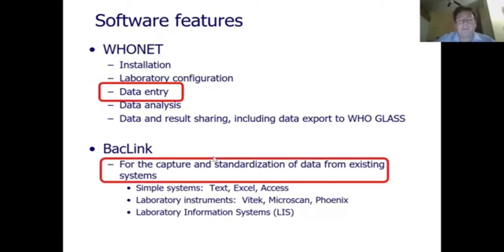If you already have a computer system, such as text, Excel, Vitek, etc., we don't want you typing the data into your system every morning and then retyping those same data into WHONET in the afternoon. We want some automated, electronic way to export the data to WHONET once a day, once a week, once a month, once a year, whenever you would like to analyze and share your data. So the focus of this presentation is data entry and BacLink to get the data into WHONET.